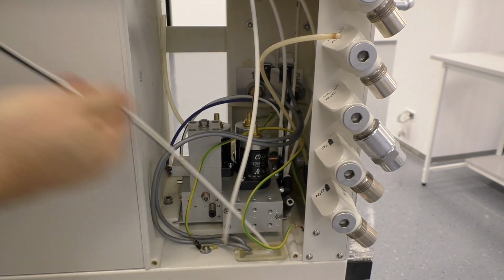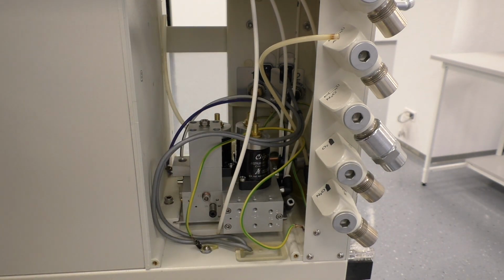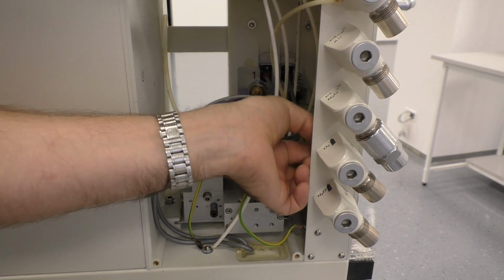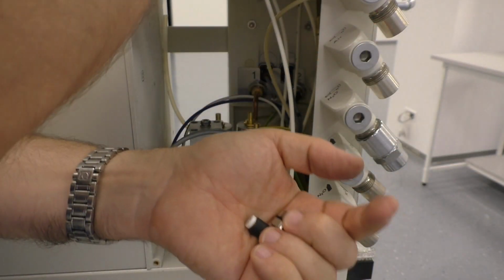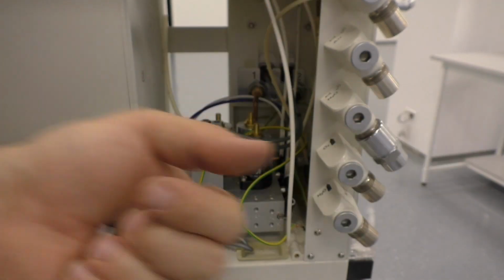Then we have more hoses to use, black and white, which is oxygen and air mixed, perhaps. I don't know what it means. Okay. And of course you can have these hose connectors with different size of threads, like this one, which is a bigger one. Oops, off camera. Like that one. So to compare it, that's the smaller one. Okay.